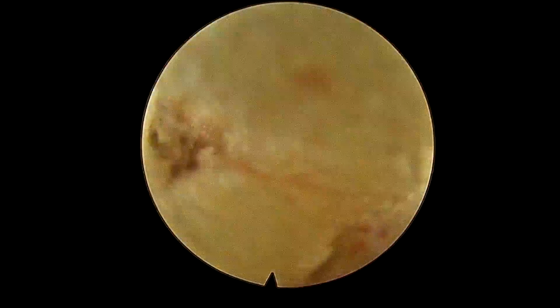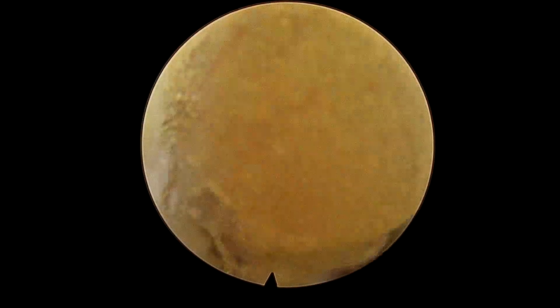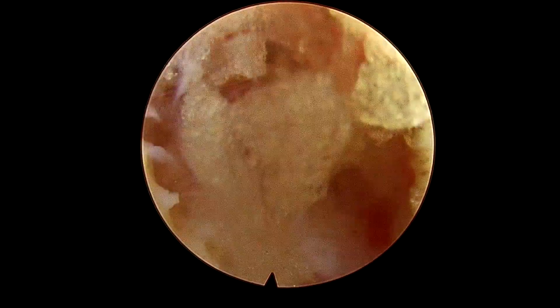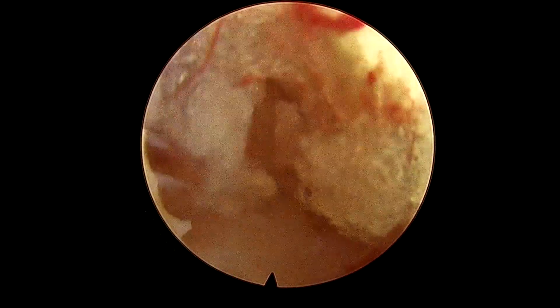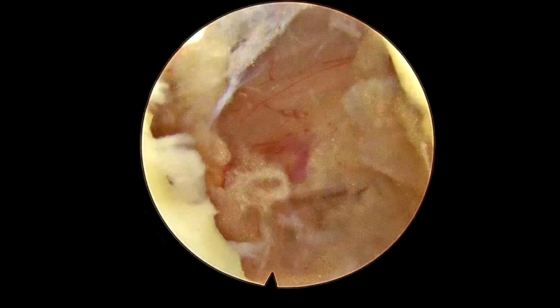So now I have removed the fat so as to visualize the structure and to understand the amount of the lateral recess decompression here. So I'm removing the overlying fat, and then I'll visualize the traversing nerve root, then visualize the border of the dura, and then we'll decide how much lateral I have to go. So again, whenever you see some bleeders, try to catch those bleeders as early as possible.